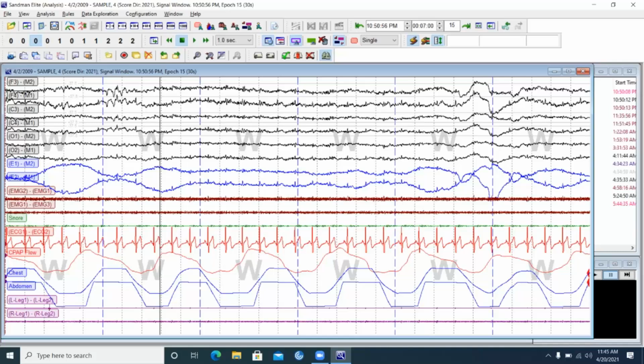Settings, filter settings. Let's review those. Just remember, we have the notch filter, the 60 hertz filter, which automatically reduces frequencies coming through in the 59 to 61 hertz range, which is what our wall outlets operate off of. So it's automatically reducing that electrical interference. It shouldn't be standard that we put it on every patient every time. Ideally, if you're doing a quality hookup, there's no need for the notch filter, but there will be instances where you need to apply it.